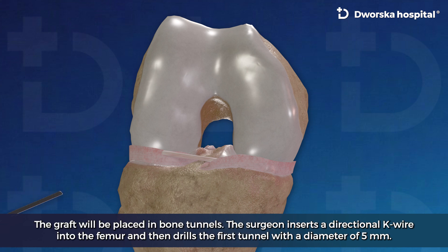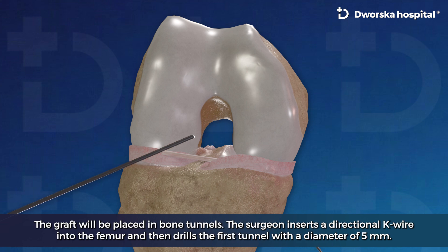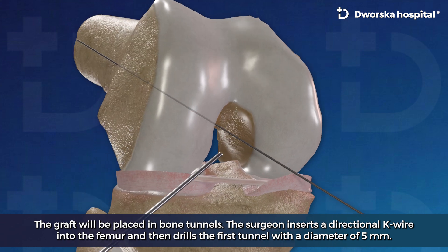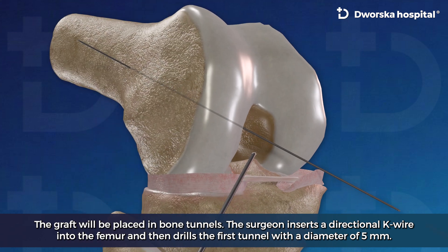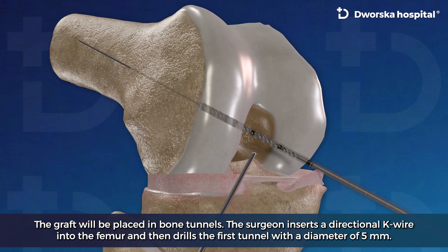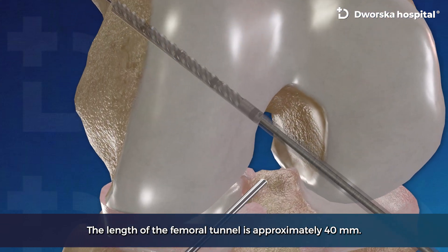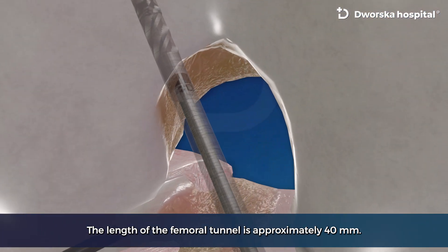The graft will be placed in bone tunnels. The surgeon inserts a directional K-wire into the femur and then drills the first tunnel with a diameter of 5 mm. The length of the femoral tunnel is approximately 40 mm.